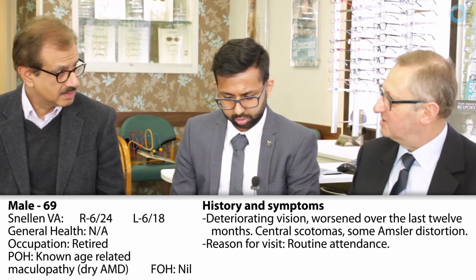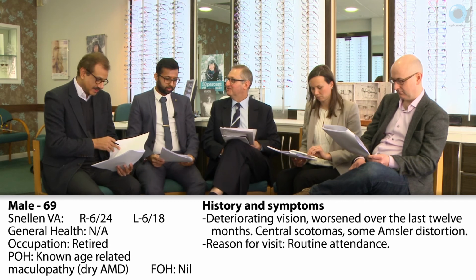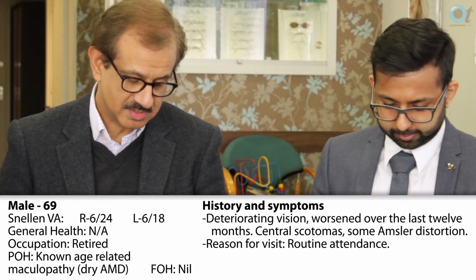Do you think of anything particular? I'm going for familial drusen. Familial drusen. Is there anything else that might come to mind then? Perhaps a smoker for many years, that's a possibility.